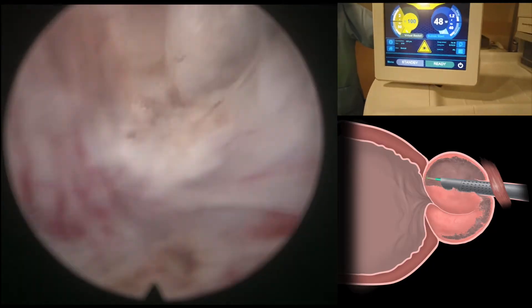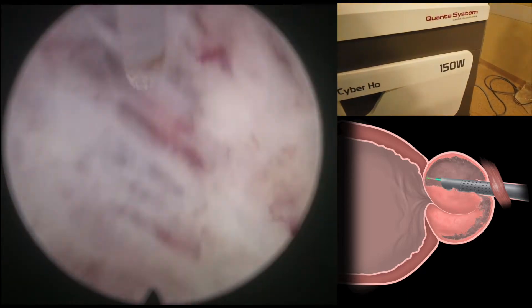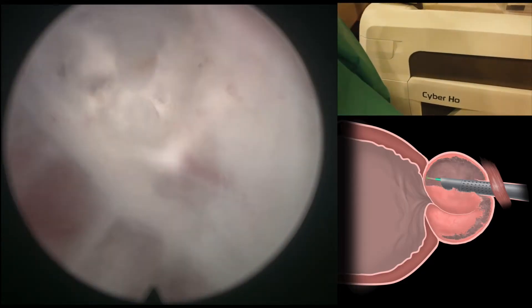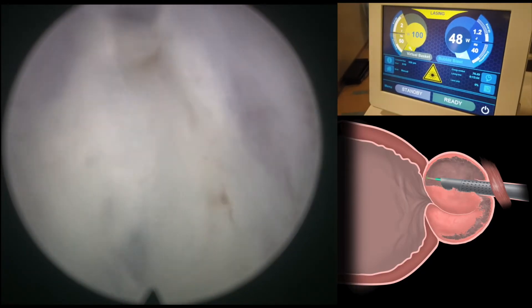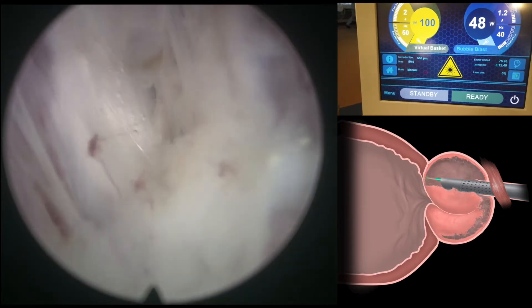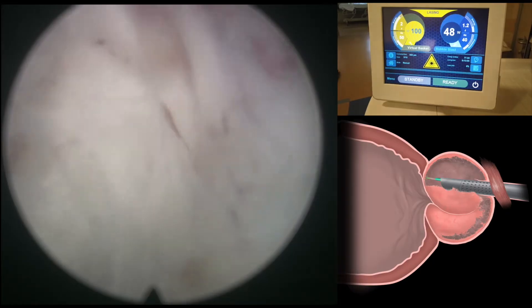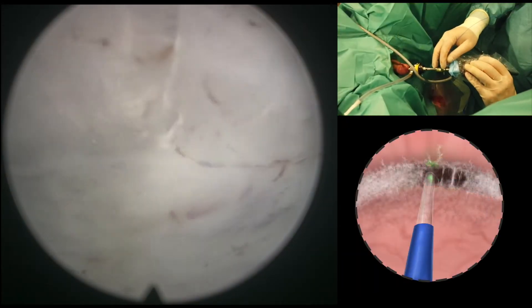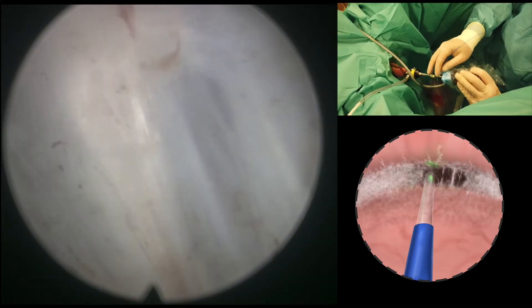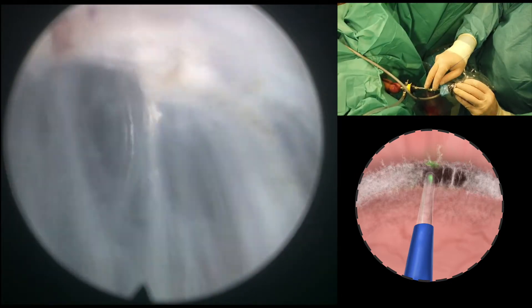This is the anterior dissection — we can go from side to side. Remember, we always want to connect the lines we are doing, so that when we are anterior we can connect easily with the lateral aspect and then with the posterior aspect. This is the development of the circumferential plane. It's important to position the scope so that the line of dissection is in the middle of the screen, which allows us to see half of the screen with adenoma and half with capsule.